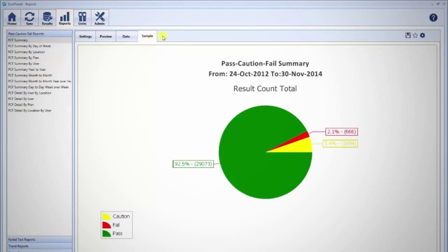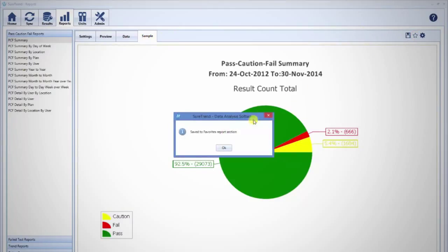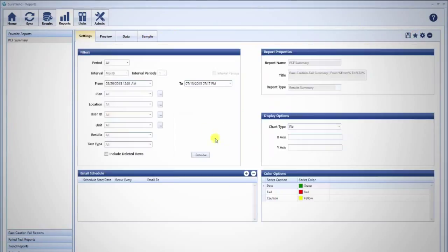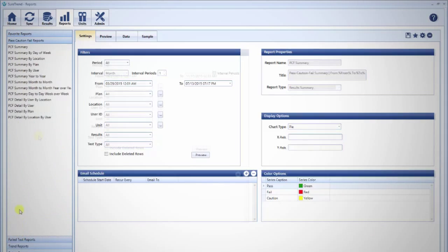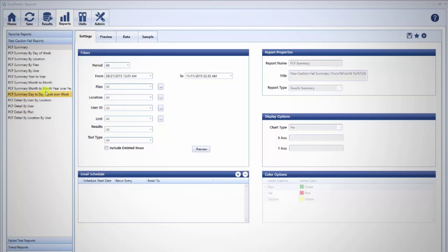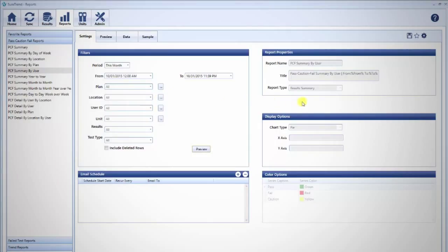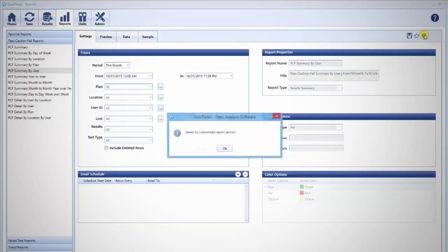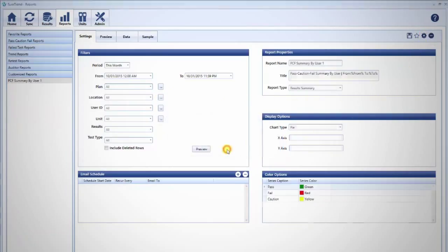Star your favorite reports to save a shortcut to the report in your favorite reports section. If you find a report that is almost perfect but want to make adjustments, click the Customize icon. This will save a copy of the report to the Customize Reports section.